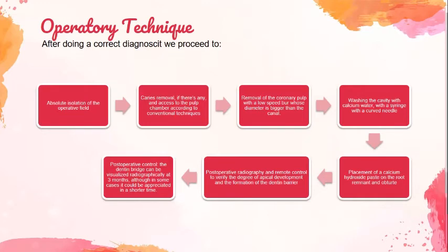Postoperative control. At the end, the dentin bridge can be visualized radiographically at 3 months, although in some cases it could be appreciated in a shorter time.